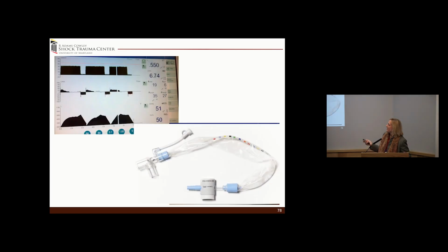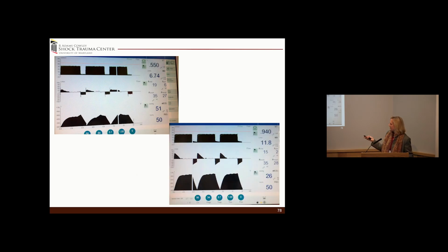Okay, so here's another example, and I've had this happen several times recently: the Ballard suction catheter got stuck down right at the endotracheal tube, so of course it's going to look obstructed, and you pull that out and voila, everything's resolved. Now, the interesting thing is you're not going to see this with PEEP. PEEP already has an expiratory retard, right? So it already is pinching on the expiratory side. So if you have a P low of 0, you're going to actually see the mechanics from the lung. You're going to see what's coming back at you.